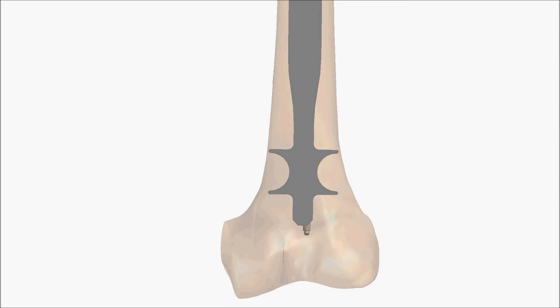Position the C-arm for an AP view of the distal femur. Starting with the talend template near the knee, move the template proximally along the thigh until all four points of the template reside within the cortex of the distal femur. This represents the tip of the longest nail recommended for that patient.